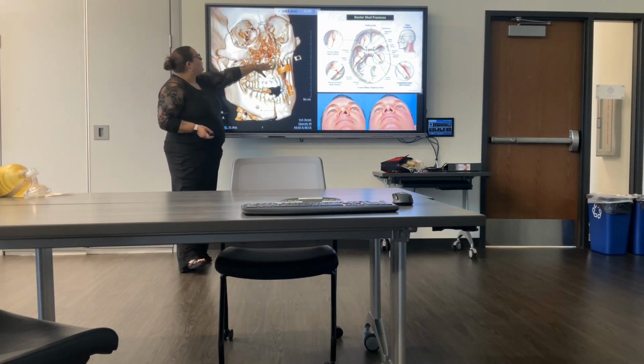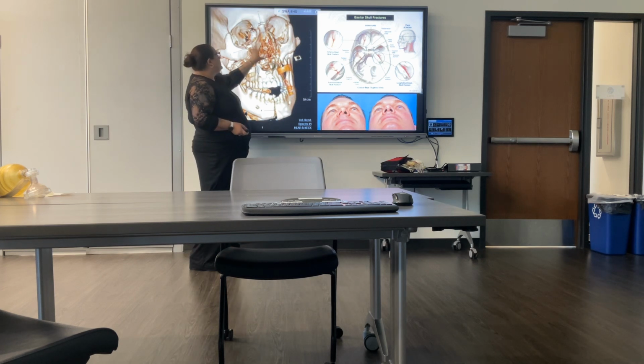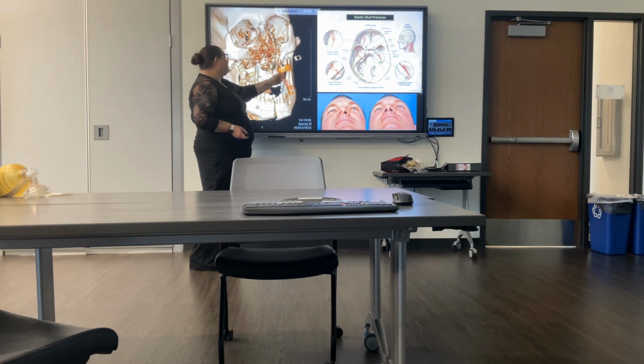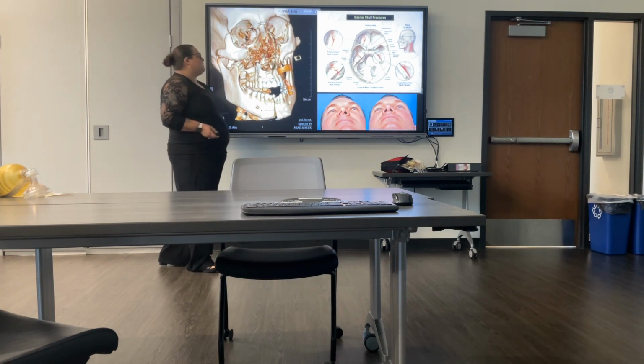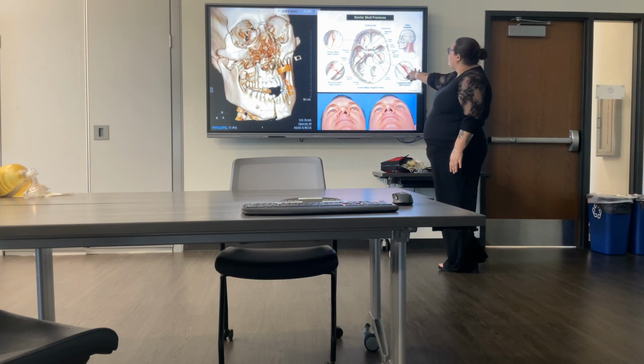All of these loose bone fragments here, when you go to facilitate an NPA insertion, you can push all of these fragments into soft tissue. This is already probably likely bleeding and causing more severe trauma. And you also see their mandible is broken, and it looks like they may have attempted to fix it, or that may be their ligament trying to hold it together. But just due to the nature of this trauma, a more invasive airway management is likely to be needed for this patient. So here you have your basilar skull fractures.